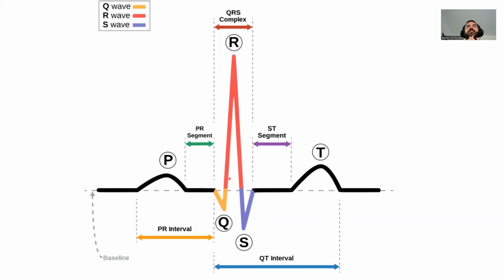When you see that big QRS, right? The thing to think about is that quivering of the atria doesn't stop, right? It's not like the atria is doing this number where it's going, oh, I'm spazzing out, I'm spazzing out. Okay, I'm going to let the ventricle contract, and now I'm going to go back to spazzing out, right? It's going to be spazzing out, and then the ventricle is going to contract as it's going, right?